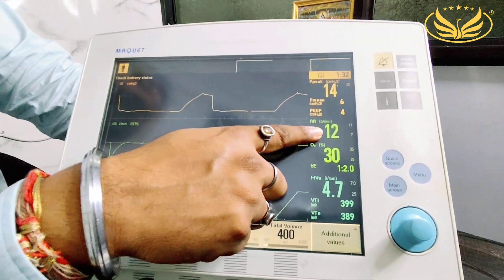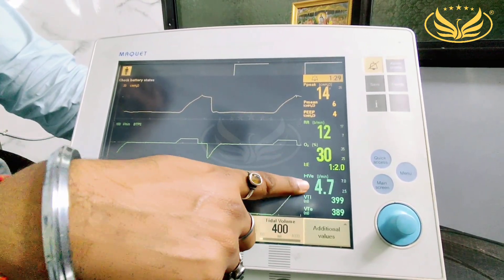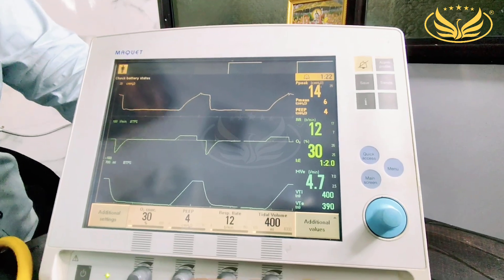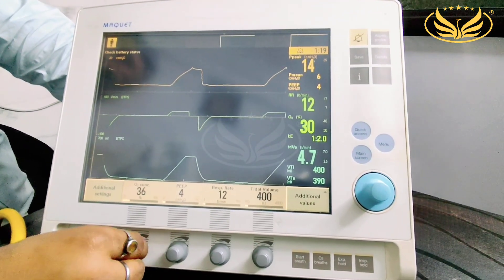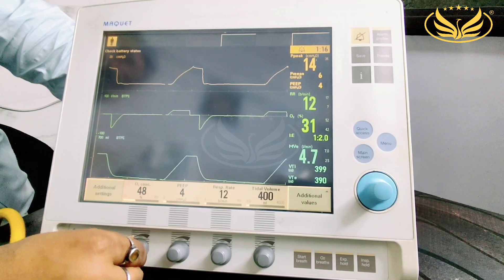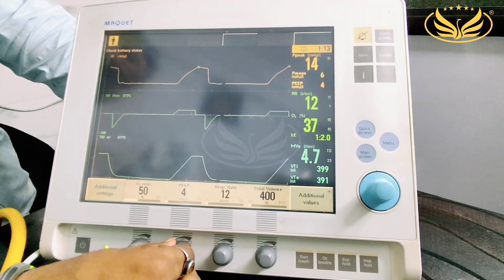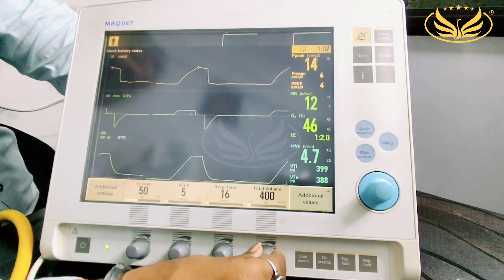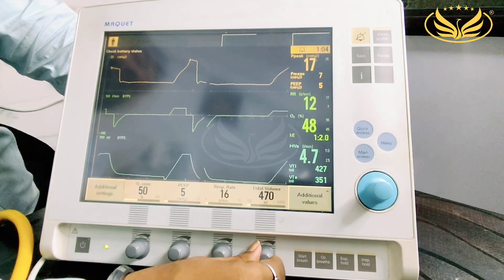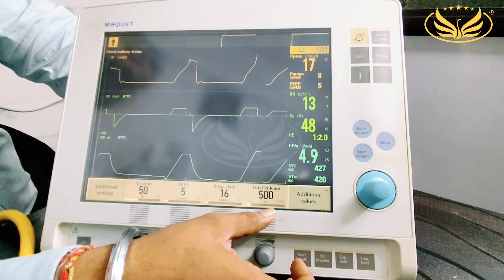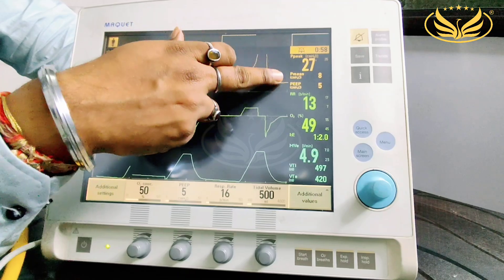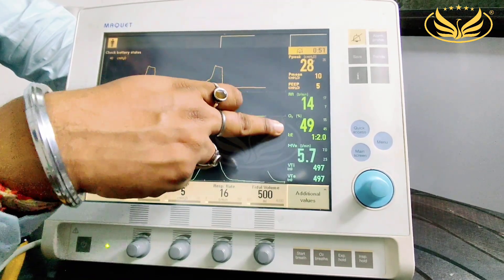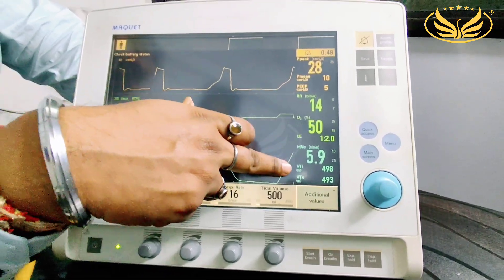RR 12 is getting delivered — 12 breaths per minute. O2 is 30%, minute ventilation and tidal volume as per the set 400 ml. The moment you change parameters, they will get changed. These are the set parameters and these are the delivered parameters, also called monitoring values. This is the set parameter, and accordingly these figures you can see are the delivering figures.